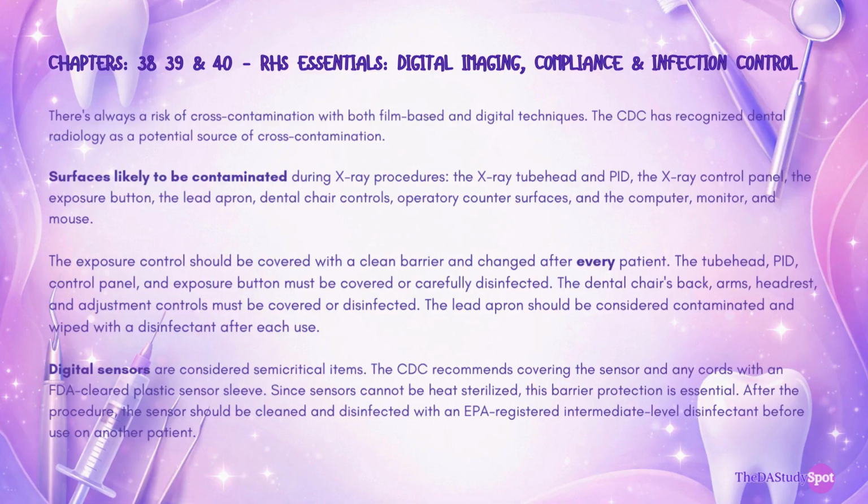Keep in mind that digital sensors are considered semi-critical items, and the CDC recommends covering the sensor and any cords with an FDA-cleared plastic sensor sleeve. Since sensors cannot be heat sterilized, this barrier protection is essential. After the procedure, the sensor should be cleaned and disinfected with an EPA-registered intermediate-level disinfectant before use on another patient.